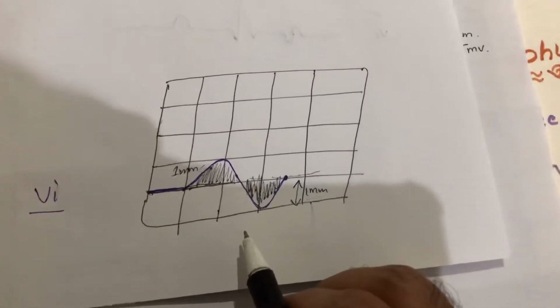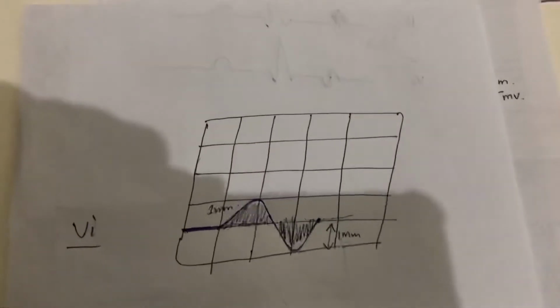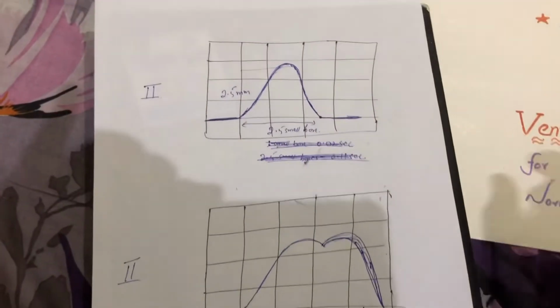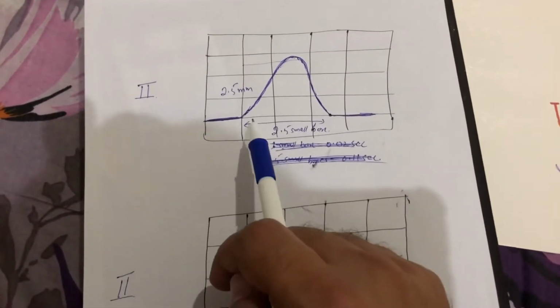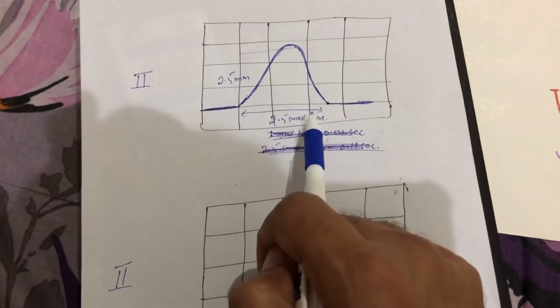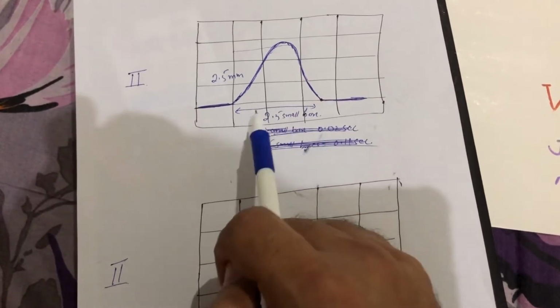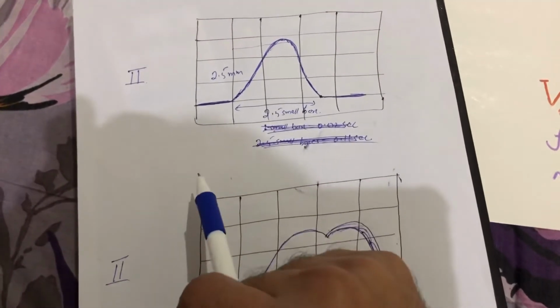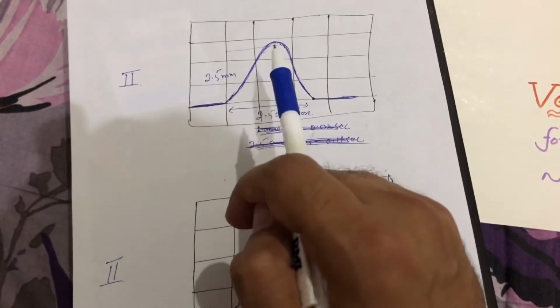Now, after understanding this core concept, it is much easier to jump into the pathology. You guys are going to understand it better, okay? There is one more point remaining to discuss before jumping to the pathologies, and that is the horizontal length of the P wave. We have already discussed it in the normal physiology of the ECG, that it will be equal to 2.5 small boxes, just as it is equal to 2.5 small boxes vertically.